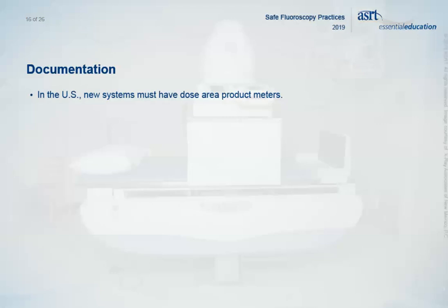In the United States, all new fluoroscopy systems are required to have dose area product meters. The dose area product measurement incorporates both radiation dose and the volume of tissue irradiated, and is an indicator of radiation risk. These meters work with other dose calculating systems to monitor and display the total amount of radiation exposure to the patient during the procedure. Practitioners then have a reference to help them avoid unnecessary exposure to the patient during procedures.